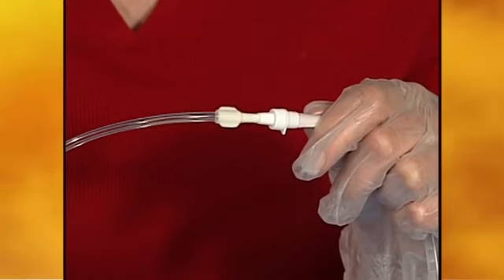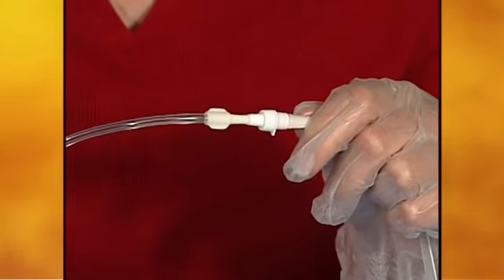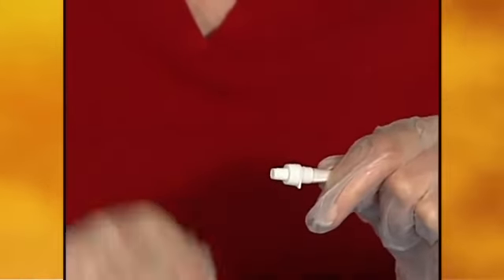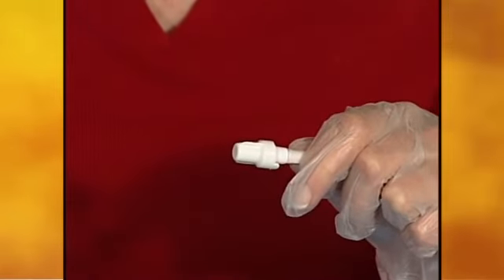To disconnect the drainage bottle from the catheter, hold the drainage line near the access tip and the catheter near the end. Pull the access tip out of the catheter. Clean around the opening of the catheter with an alcohol pad and twist the new cap into place. A slight click will be heard and felt as the cap locks.